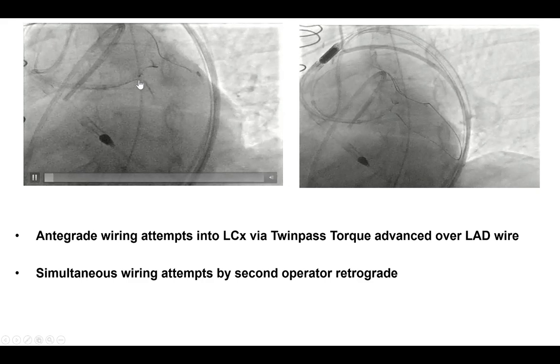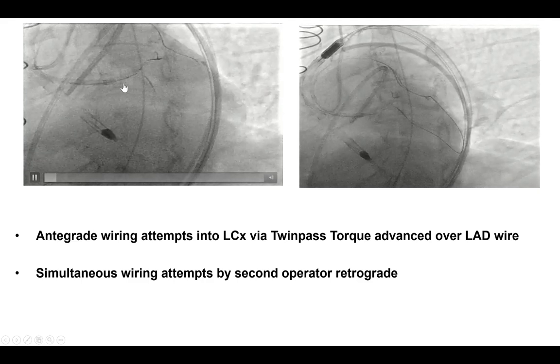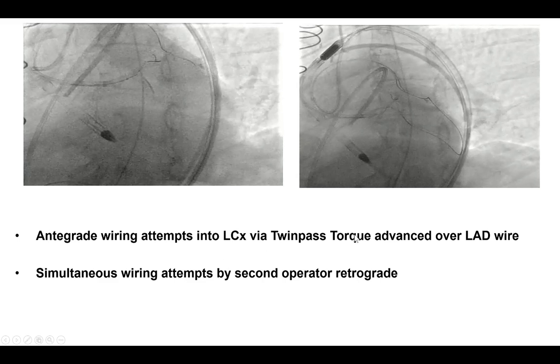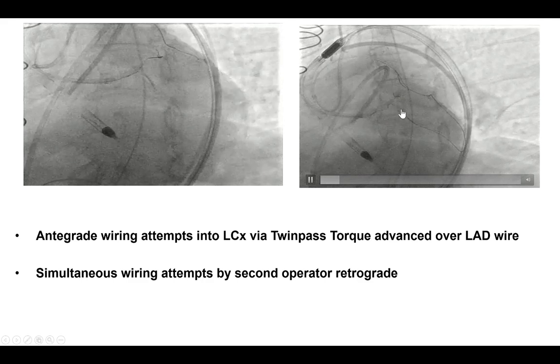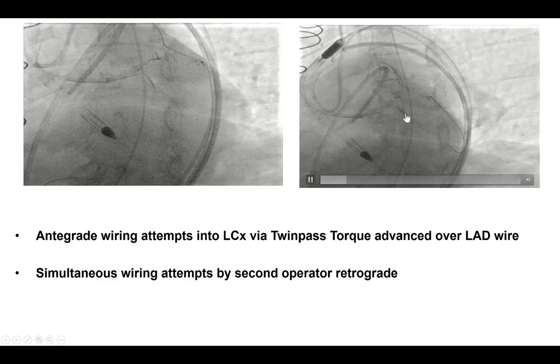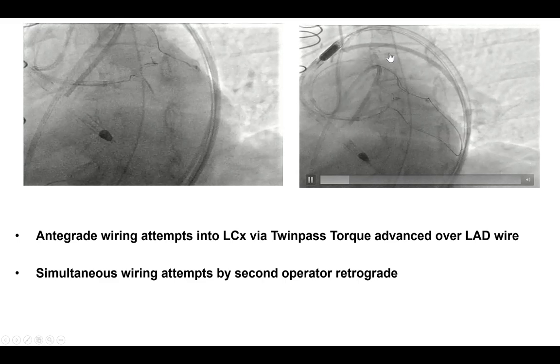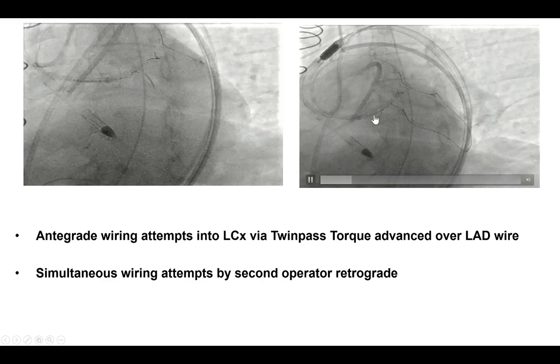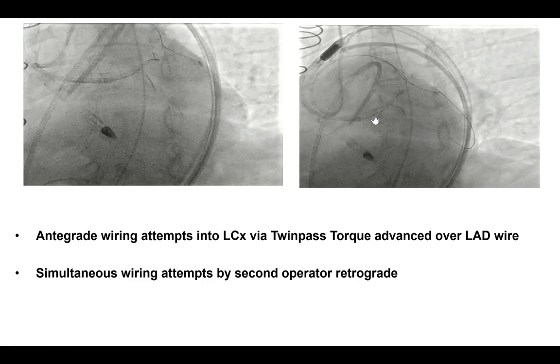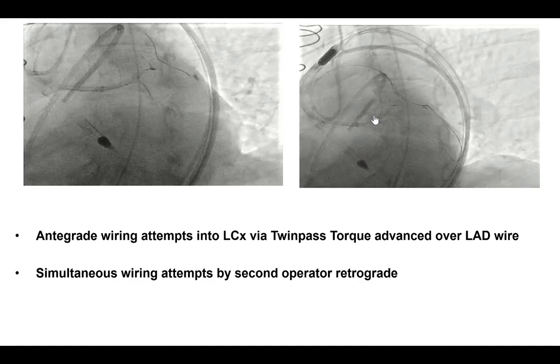We made further antegrade crossing attempts using a Twin Pass dual-lumen microcatheter, but unfortunately were not able to cross once again. This was done simultaneously with one operator working on the antegrade direction and a second operator working through the retrograde direction — one way to optimize the efficiency of the procedure when two operators are available.